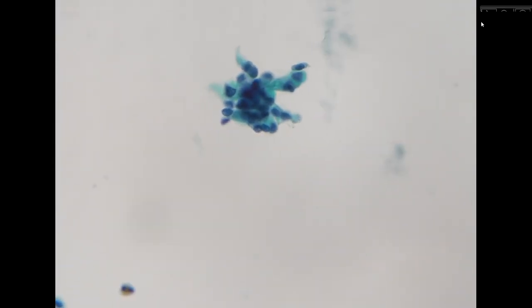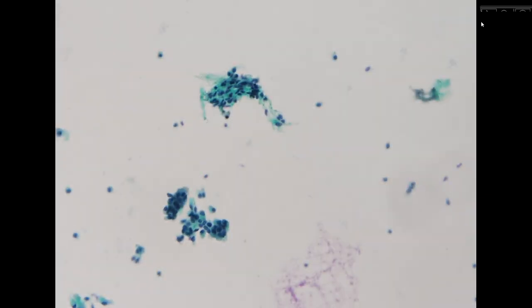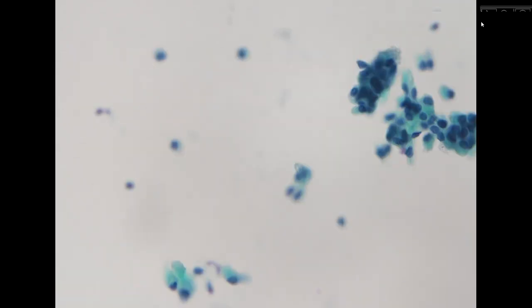The problem is that for this specimen, we do not find a very prominent fibromyxoid or chondromyxoid matrix material. Some of the cells do have a more spindling pattern, which is more suggestive of a myoepithelial origin, and the others are a little bit difficult to determine.